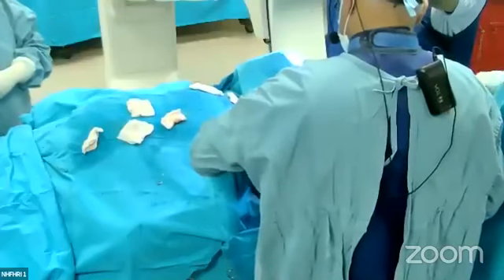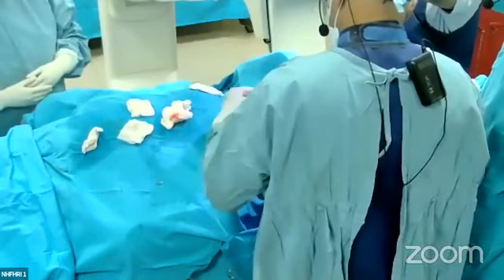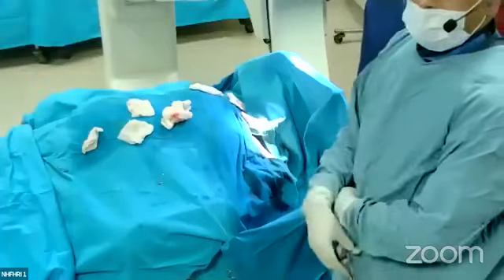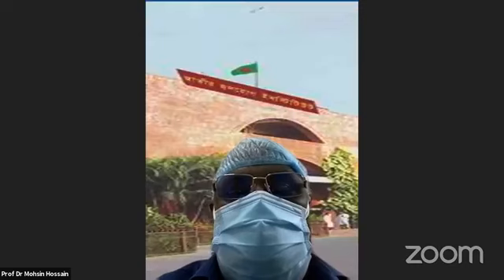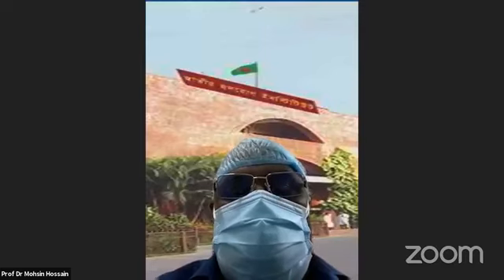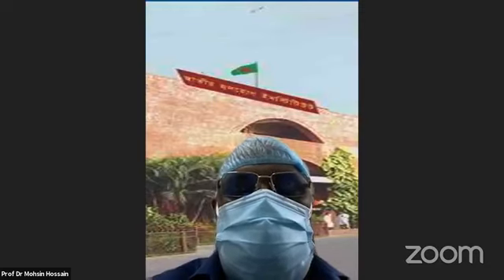Just give it. Yes, that looks right. Dada, do you close with silk or subcutaneous closure? Silk on the skin, and Vicryl inside. I practice with subcutaneous Vicryl, right? Okay. Because silk is sometimes mainly for wound apposition, and it will take 5 or 10 minutes more.